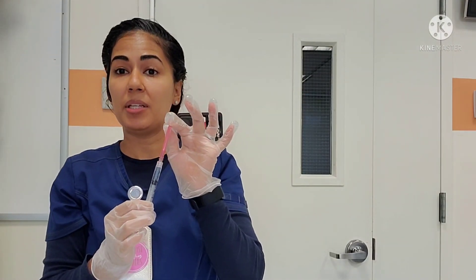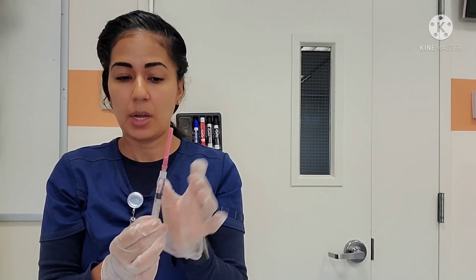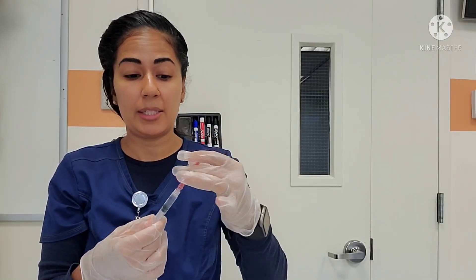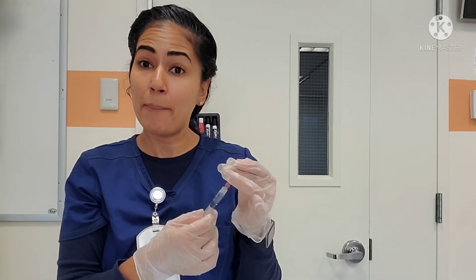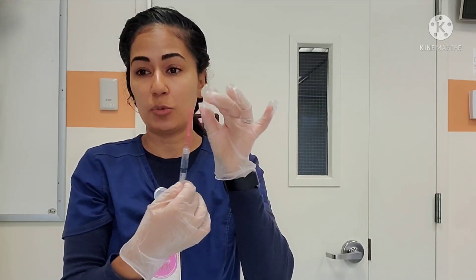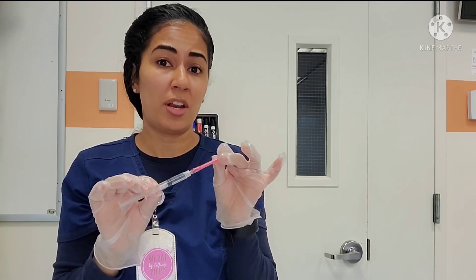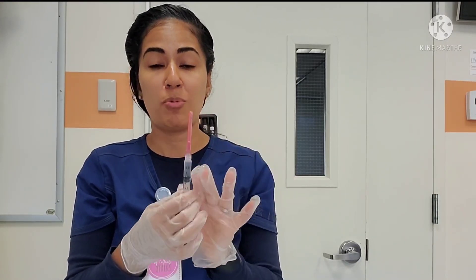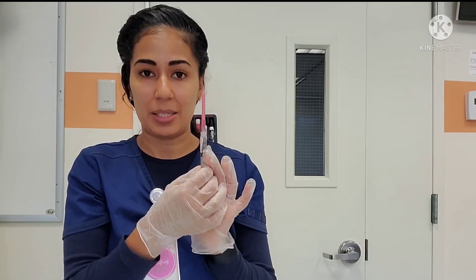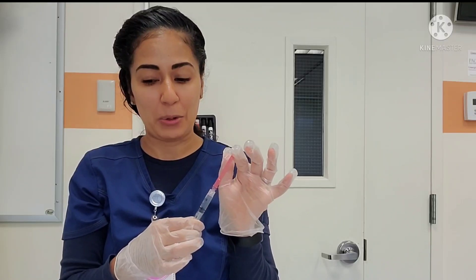Now I'm going to keep this on. If I was going to be giving this medication IV push, I'm going to keep the blunt needle on because it is protecting my syringe. If I was going to give this IM or sub-Q, now I can go ahead and change my needle and put the appropriate needle. Because remember, this is a blunt needle — this is not the needle I'm going to use to inject into my patient. I only use this because it had the filter to prevent any glass shards from getting into the ampule. So I would change my needle and this would go into the sharps container. And that's how you withdraw a medication from an ampule.